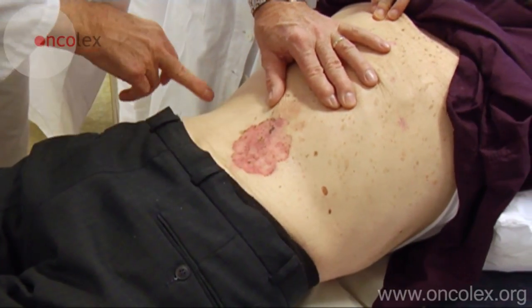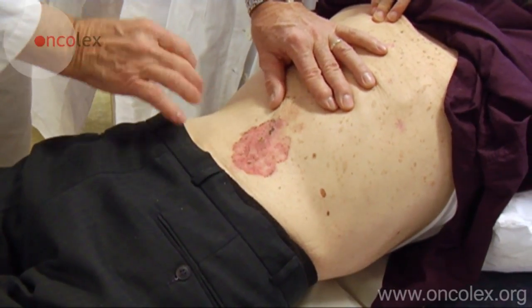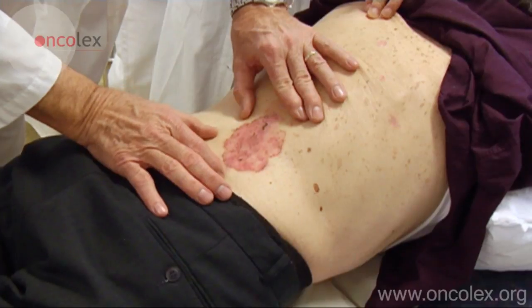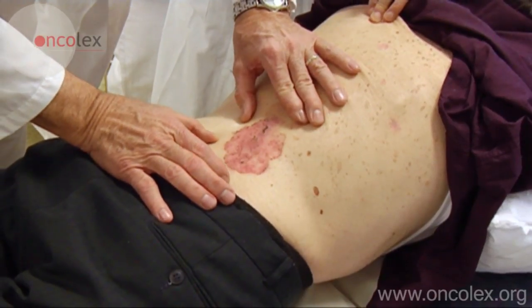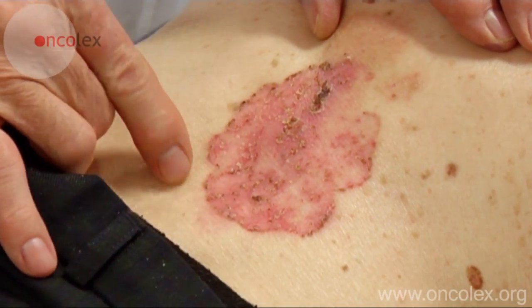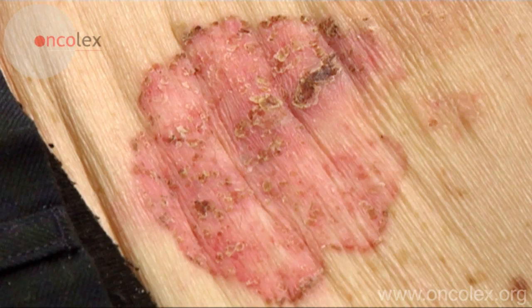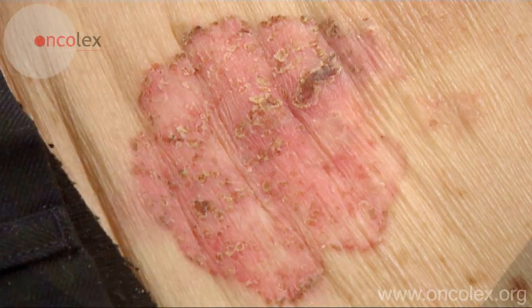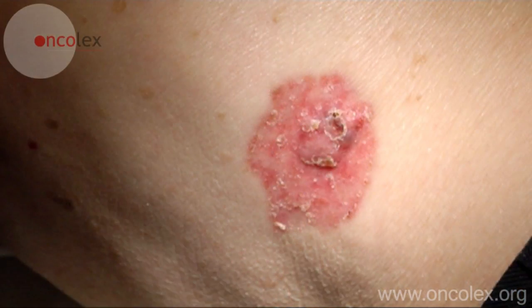This is a different patient. He has a 6 cm large lesion medially on his back. He also has a nodular lesion laterally to the left of this.